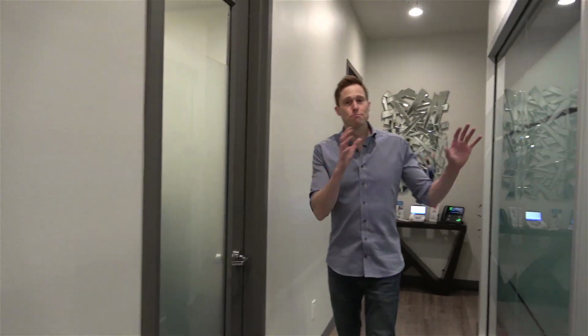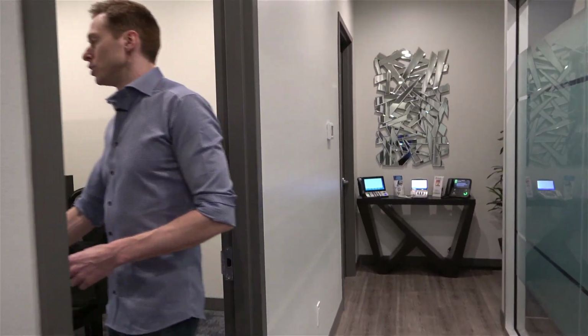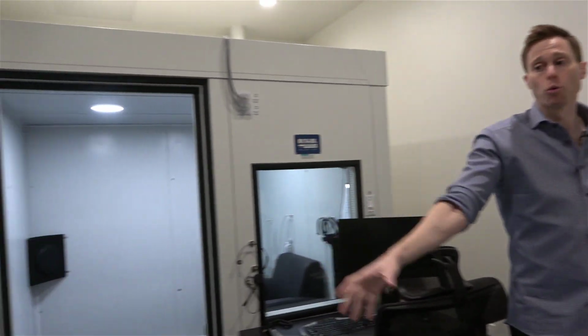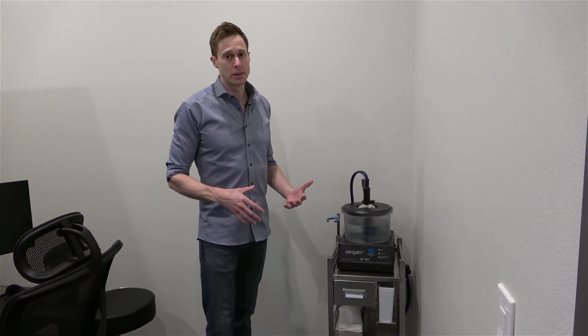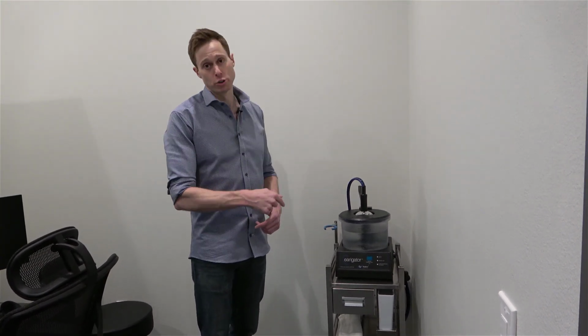Before we get into my room, I'm going to show you the test booth room. So let's go ahead and check that out as well. You can see that we did put the privacy frosting on these doors as well. They are not all glass, but they have a sturdy core wood with an inlay of glass on there as well. Over here in the corner, this is kind of where we store our irrigator. If you don't know what the irrigator is, you may know someday, because this is what actually blasts earwax out of your ears. Really, really effective piece of equipment here. If you have impacted earwax that you just can't get out, this is the tool that'll do it for you.